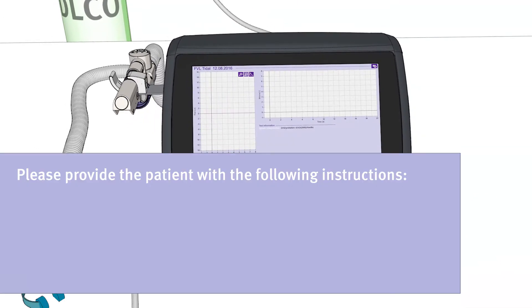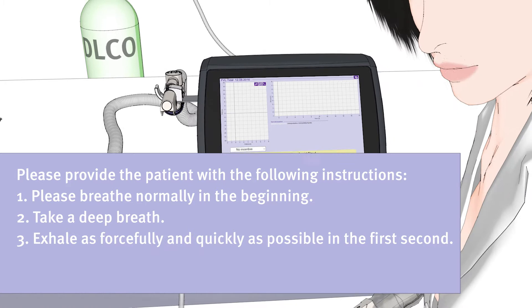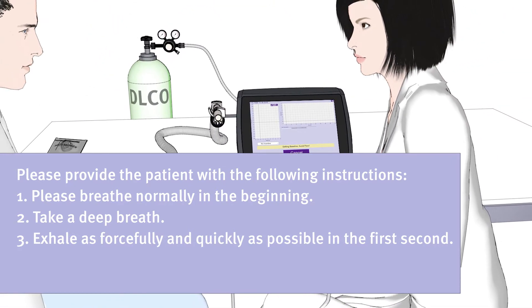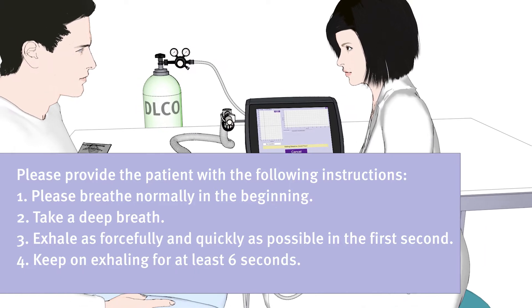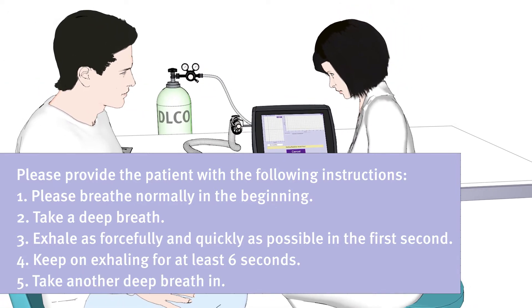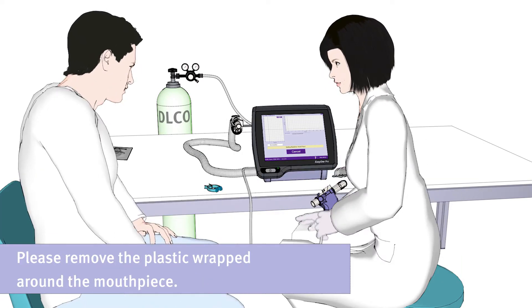Please instruct the patient to breathe normally in the beginning, then take a deep breath, then exhale as forcefully and quickly as possible in the first second, then to keep on exhaling for at least six seconds, and then to take another deep breath in. Now, please remove the plastic wrapped around the mouthpiece.